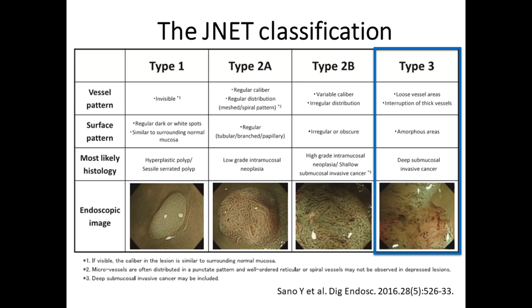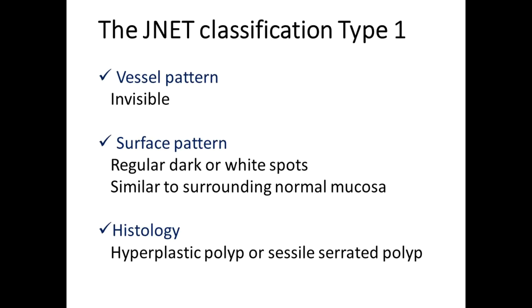Now, we will present typical cases of each J-Net type. J-Net Type 1 polyps do not have specific patterns of vessels and surface structures, so the vessel pattern is invisible and the surface pattern is similar to normal mucosa. Regular dark and white spots are often observable on the surface. Polyps with such findings are predicted to be hyperplastic or sessile serrated polyps.